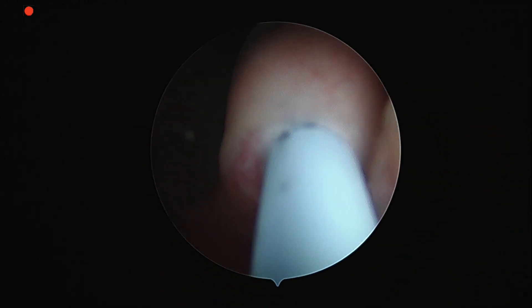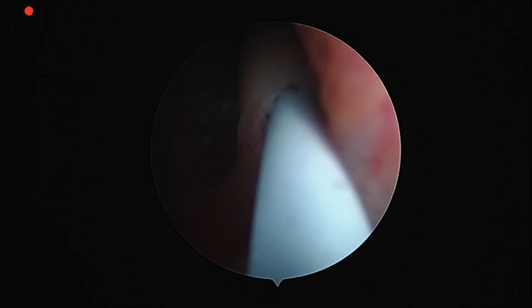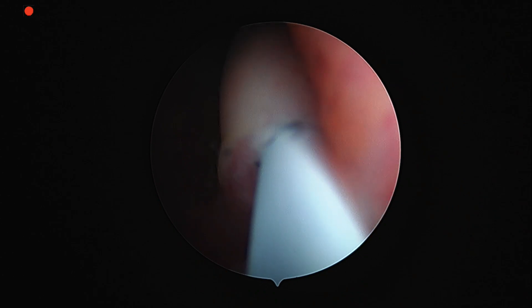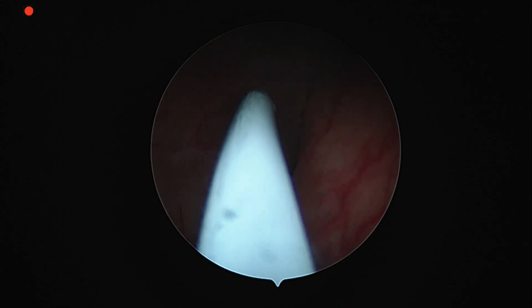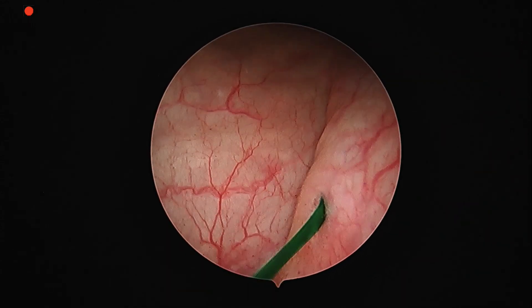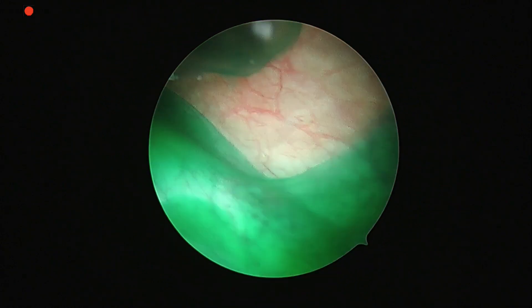Now 5 ml of ICG is injected into the left ureter. The ICG comes at a dose of 25 milligram powder in a single vial, usually mixed to 5 cc. Since we have to inject it into both ureters, we mix it and make it 10 cc — 5 cc in each ureter. Now we can see the ICG coming out of the left ureter.